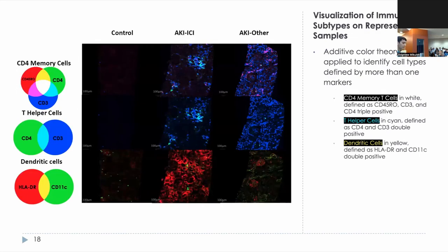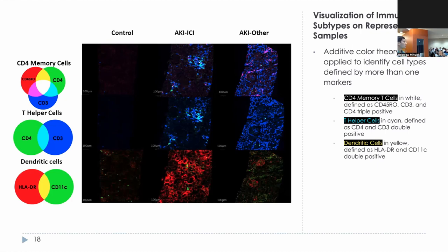As the old saying goes, seeing is believing — so it's important to validate that our results are consistent with what's in the images themselves. Using additive color theory, we can visualize the triple-positive populations of interest. CD4 memory T cells were defined as CD45RO, CD4, and CD3 triple positive — with each single positive population assigned a primary color, the triple positive population appears in white. T helper cells shown in the middle row were CD4 and CD3 double positive, appearing in cyan (a mix of green and blue). Dendritic cells, defined as HLA-DR and CD11C double positive, were shown in yellow.